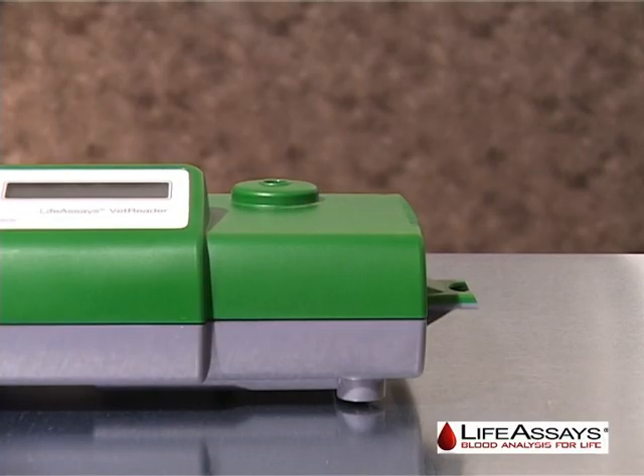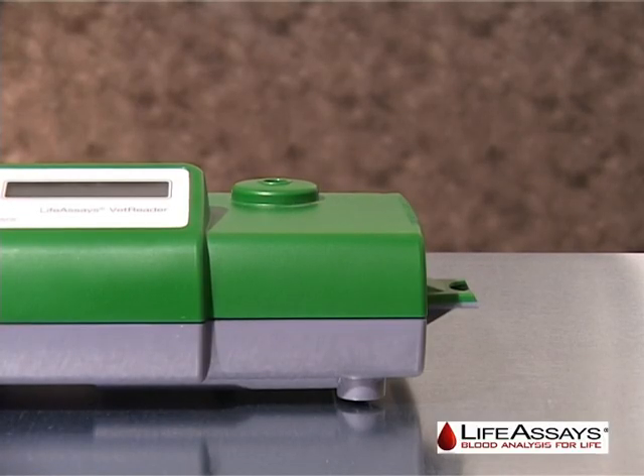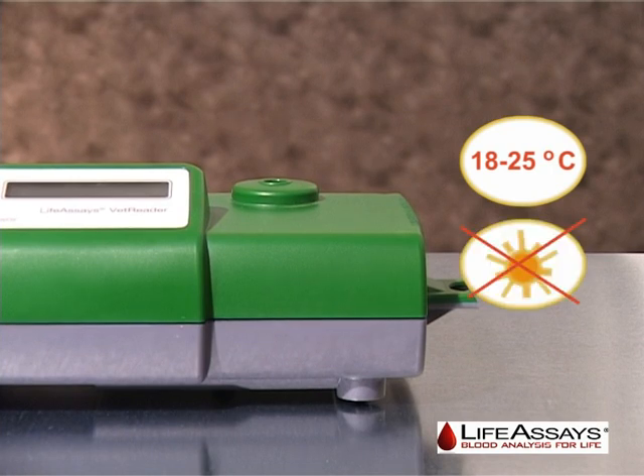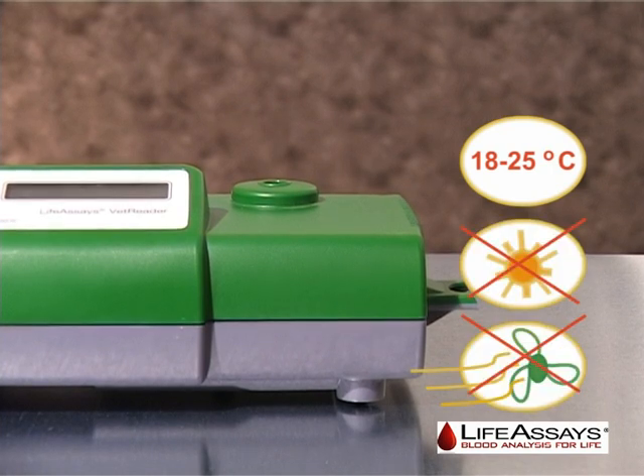Place the instrument freestanding on a level surface. The required ambient temperature is between 18 and 25 degrees Celsius. Avoid direct lights, fans, and dirt.